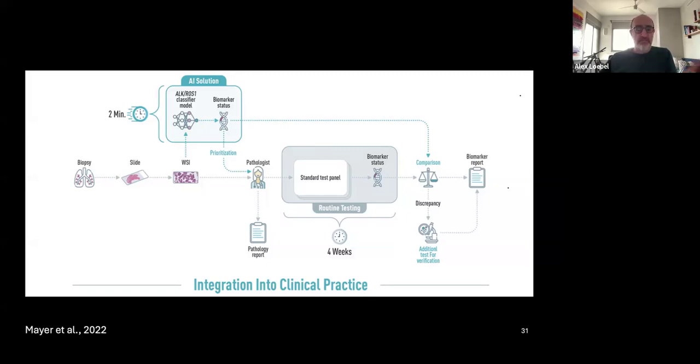We are using many of his models in the lab, and he just released a foundation model, trained in his lab about a month ago, that was augmented with transcriptomics data.